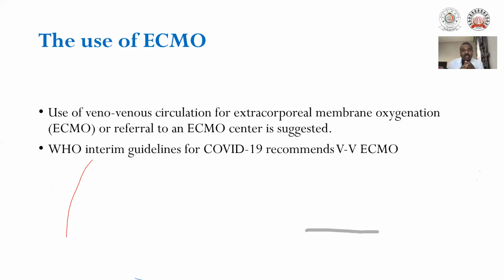Use of veno-venous circulation for ECMO in a referral to an ECMO center is usually suggested. The WHO interim guidelines for the management of suspected COVID-19 also recommend administering veno-venous ECMO to eligible patients with COVID-19, but the recommendation is weak. It's not a very strong recommendation at present.